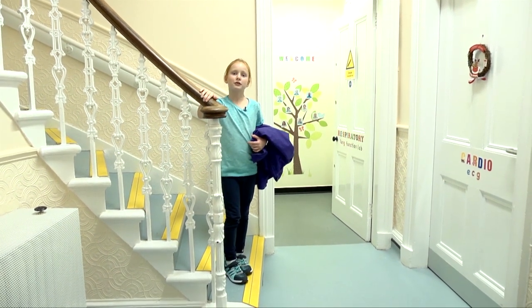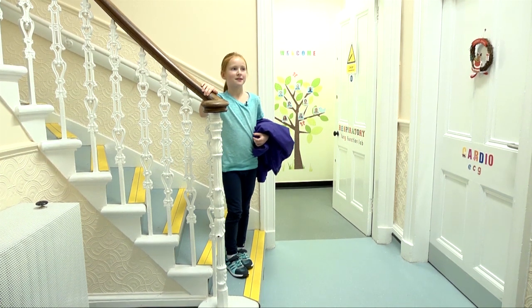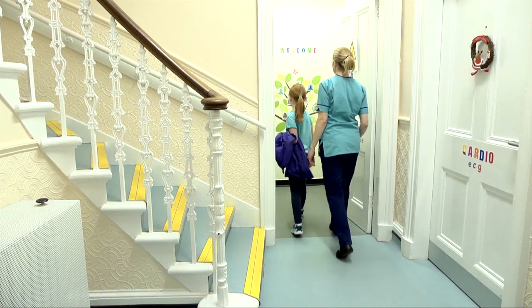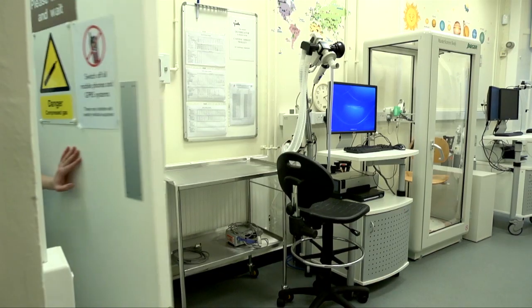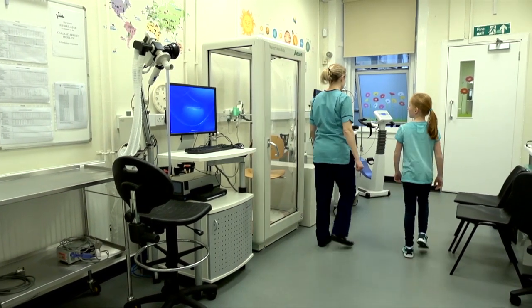This is a video clip about when doctors check how your body works whilst doing exercise. Okay Susan, do you want to come through? This is where we'll do your exercise test. Can I just get you to give your hands a little rub with the hand gel on the way in? In you come Susan. I'll take you across here to our machine that we're going to use for doing your exercise test.